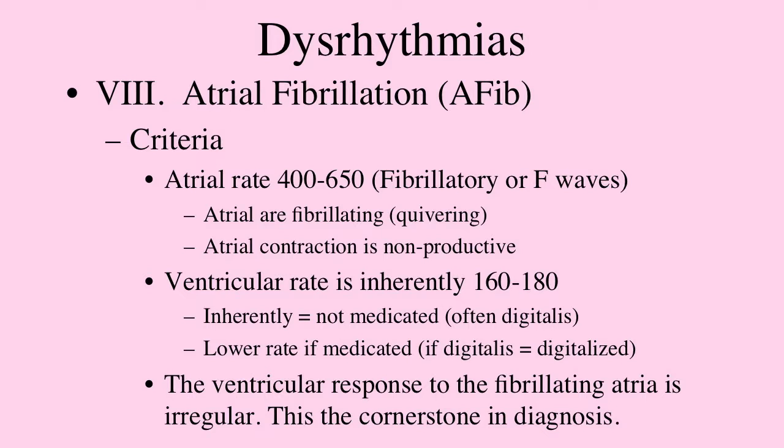Another thing you can see on here is that the QRS complexes are often irregular. They don't beat regularly; they can beat, then go a little faster, and then have a pause. That's a common thing, the cornerstone in the diagnosis of atrial fibrillation. In this case, the best way to get the rate, as we talked about earlier in the course, is to look at a 6-second strip of the EKG, count the number of beats in that 6-second period, and then multiply by 10 to get the ventricular rate in atrial fibrillation.